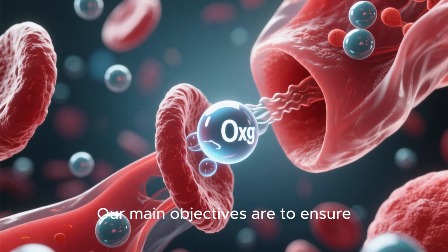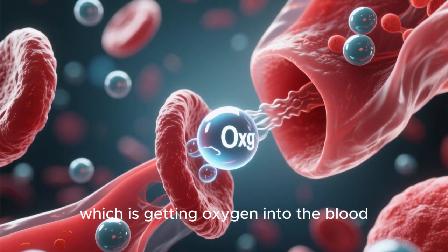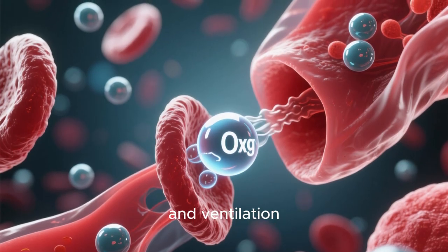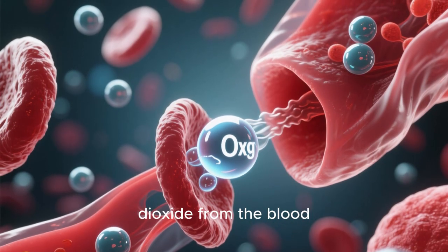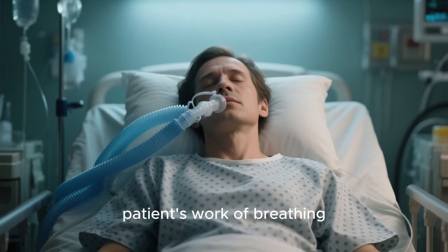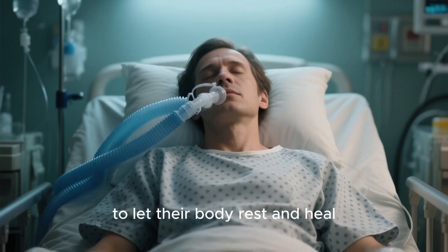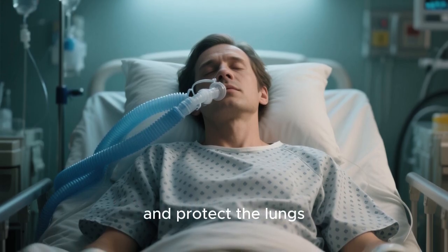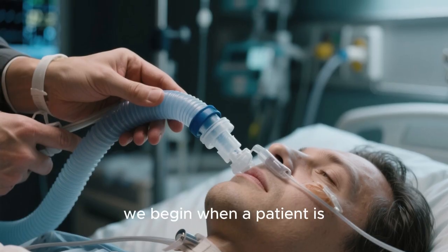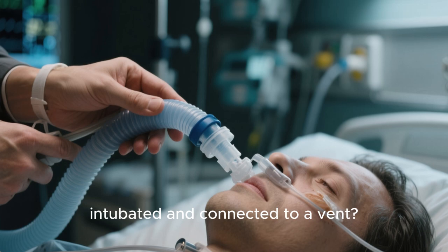Our main objectives are to ensure adequate oxygenation, which is getting oxygen into the blood, and ventilation, which is removing carbon dioxide from the blood. We also want to reduce the patient's work of breathing to let their body rest and heal and protect the lungs from further injury.